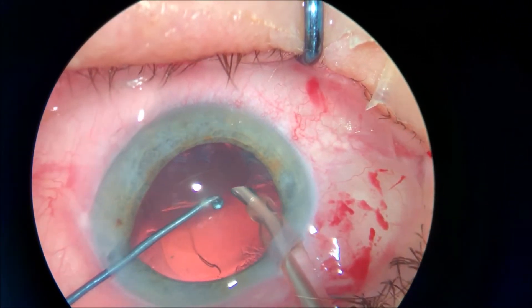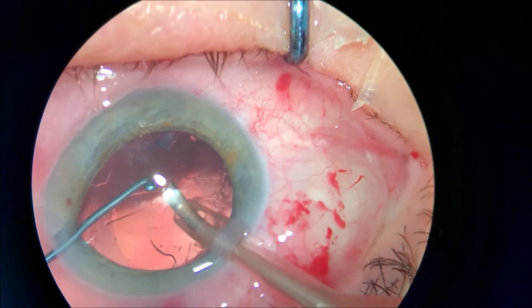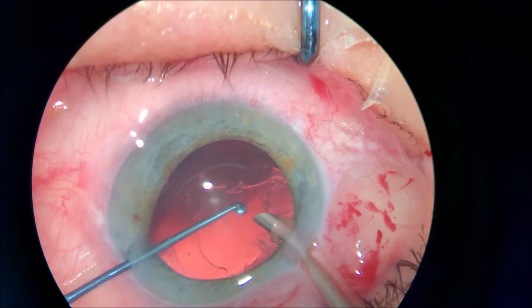Whether you use an aspiration needle, an irrigation-aspiration port, single port, or whatever you might choose, I think you can do a very fine job using the FACO probe as well.